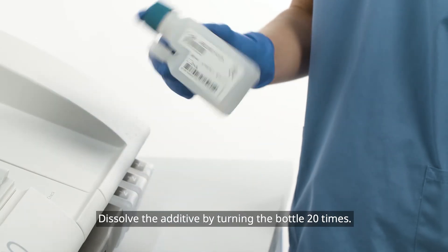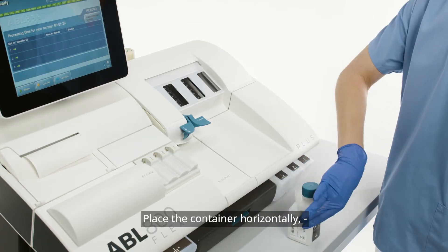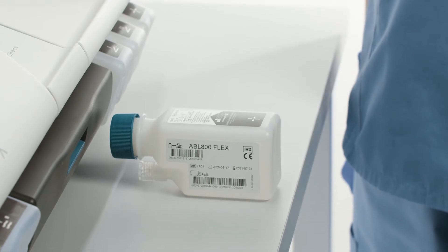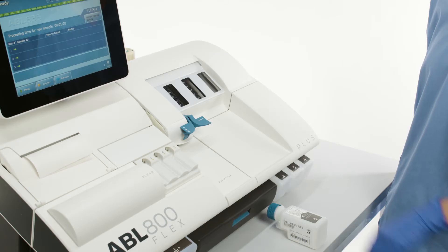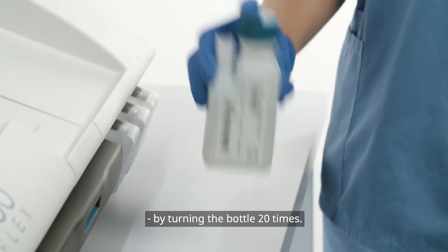Dissolve the additive by turning the bottle 20 times. Place the container horizontally so the solution can enter the dozy cap zip. This will take about three minutes. Dissolve the additive again by turning the bottle 20 times.